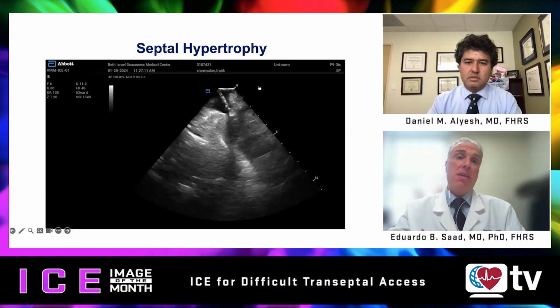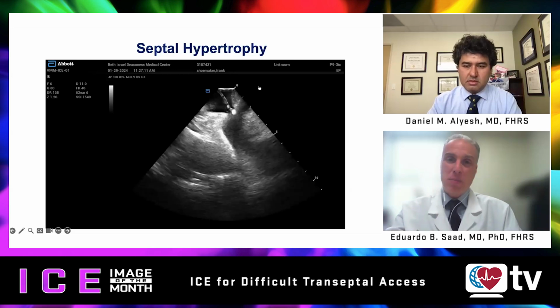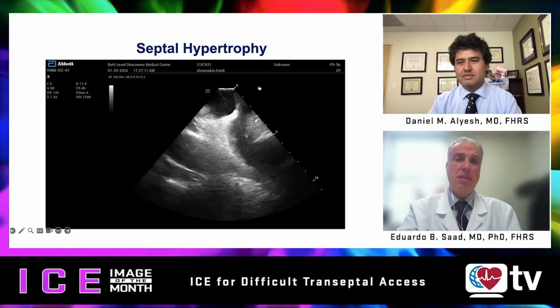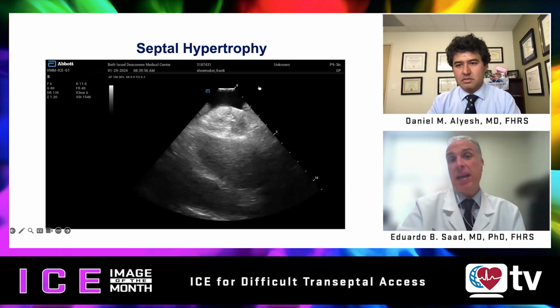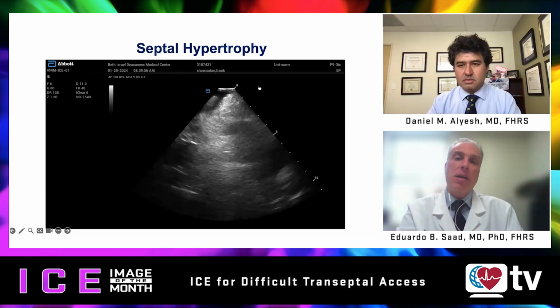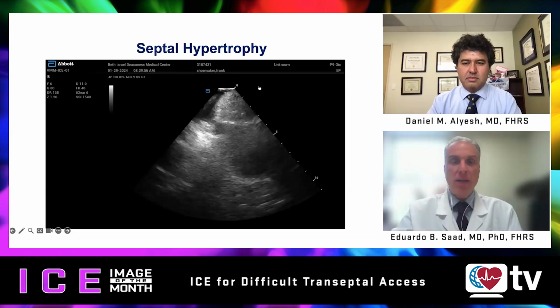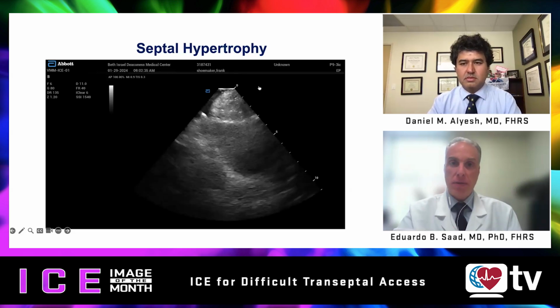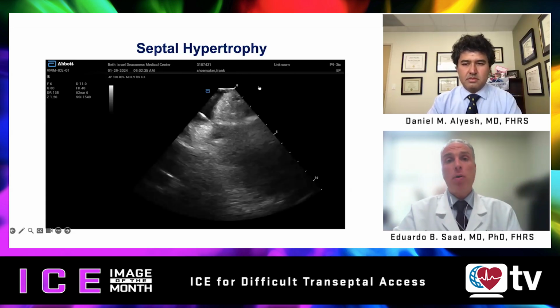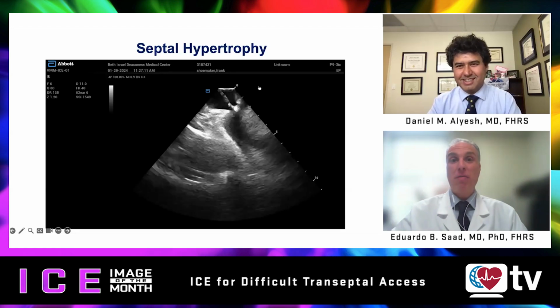And the second task was actually educating other people in using it. Because once you show those images, most people say, oh, I love it, I want to do it, but I can't get those images myself. So actually engaging in educational programs to allow other people to have their learning curve and use that amount of advanced imaging is very important, because then you're not the only man trying to sell that technique, but everybody's pushing for it.